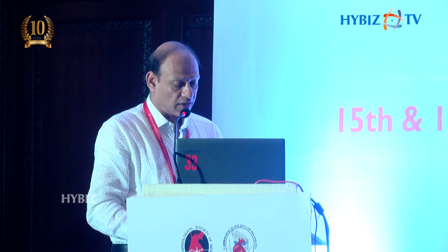Calcium scoring systems are very well defined with OCT when compared to IVUS. The calcium thickness, the length of the calcium in the vessel wall, as well as the arc of calcium decide the way to go ahead, whether it is atherectomy, scoring balloon, rotablation, and whatnot. So you have a lot of advantages with this.